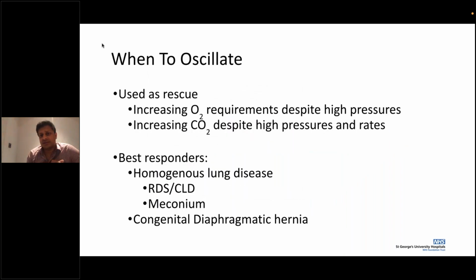Now, key targets of high frequency: commonly we use it where, in conventional ventilation, your mean airway pressure keeps going up, and that would be the time that you would consider high frequency ventilation. Quite commonly, you will see it with severe sepsis babies or meconium aspiration, and surgical babies like congenital diaphragmatic hernia. But in a diaphragmatic hernia, that wouldn't be a go-to mode. But of course, we have a low threshold to go to high frequency because of the tidal volume benefits.